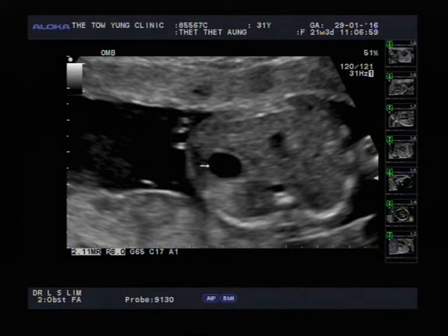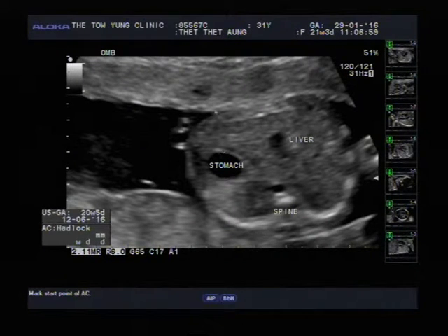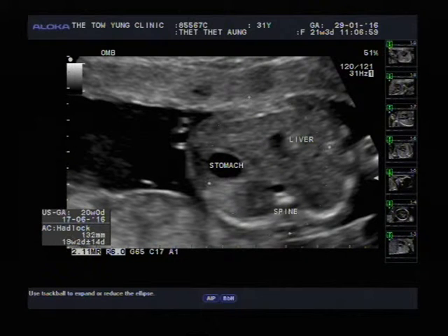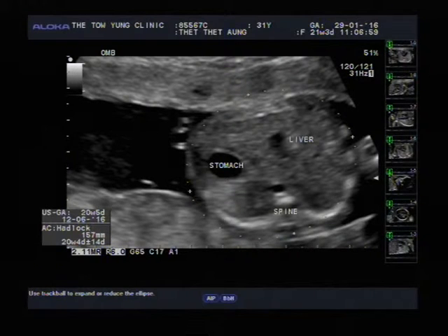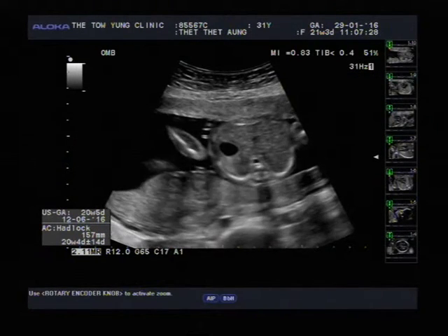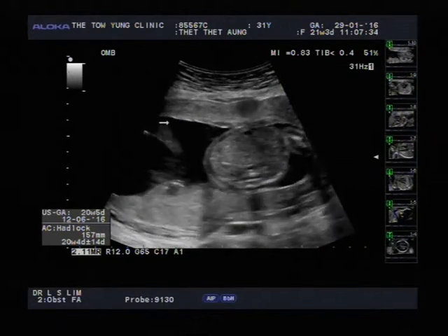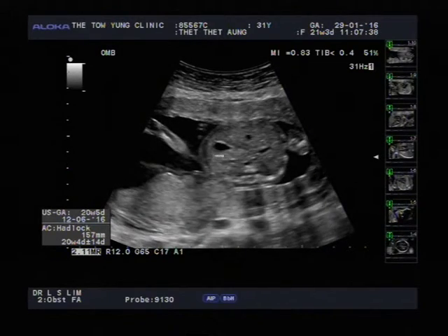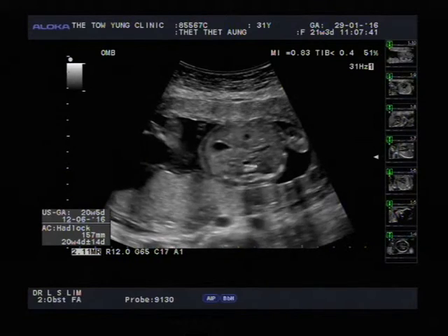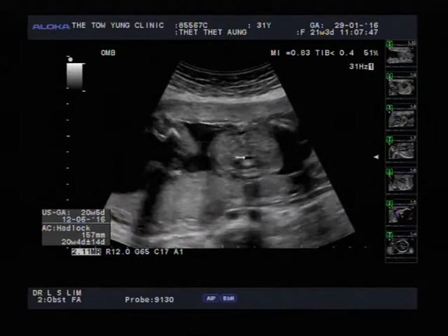In this cross-section you can see the stomach — it's the bubble here — and the backbone is of course at the back. The liver is over here. At this point we do a measurement called the abdominal circumference — the circumference of the abdomen. This measurement is 15.7 centimeters, equivalent to 20 weeks and 4 days, plus or minus 14 days, which is normal for 21 weeks. Going lower down — kidney shadows on the left and on the right beside the spine. The spine separates the right and left kidneys on both sides.